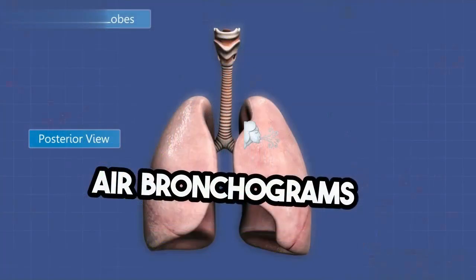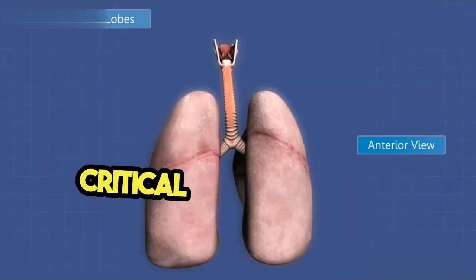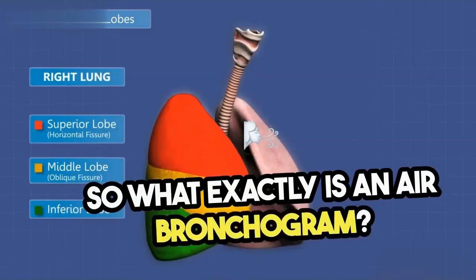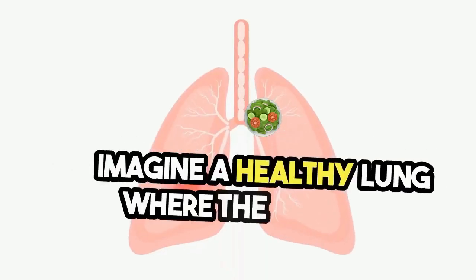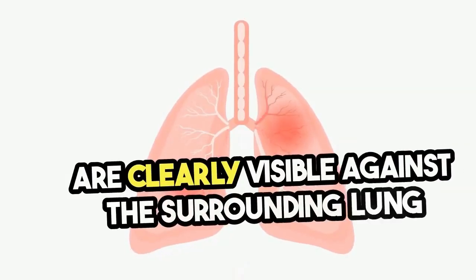Air bronchograms are a fascinating and important radiological sign that can provide critical insights into lung pathology. So, what exactly is an air bronchogram? Imagine a healthy lung where the air-filled bronchi are clearly visible against the surrounding lung tissue.